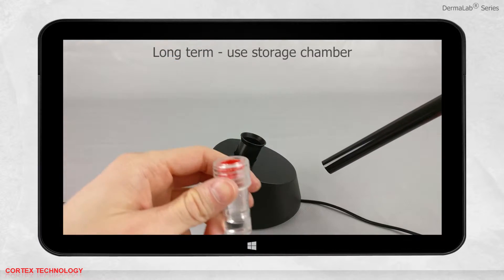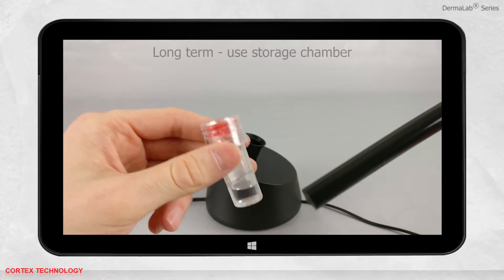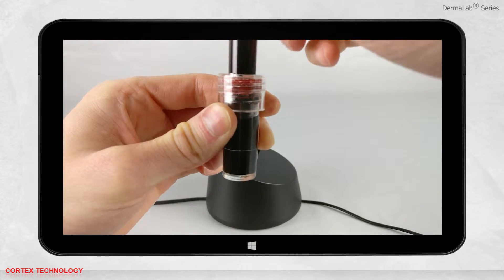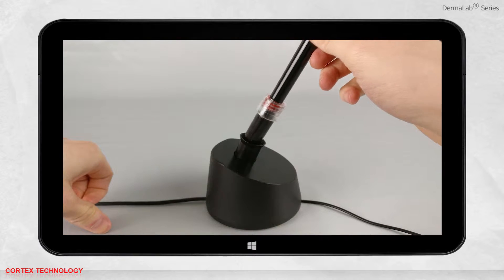For long term storage, we recommend using the storage chamber. It is very important that the probe is all the way down when placing it in the chamber. Remember to tighten the lid and place it back into the table stand.